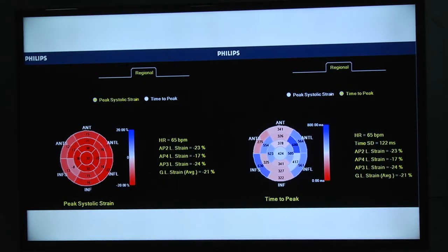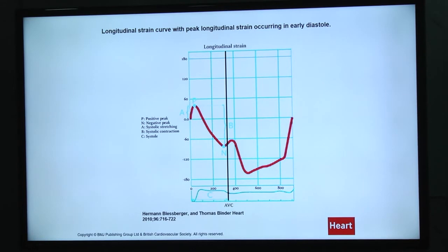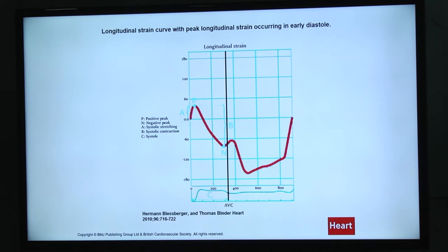Not only absolute values of strain are important, because hypokinetic parts can reach maximum deformation similar to normal segments, but they do it in a delayed way. When we face tardokinesis — that's when 20% of deformation occurs after aortic valve closure — that's a positive sign of inhomogeneity of that segment and an early sign of hypokinesis.